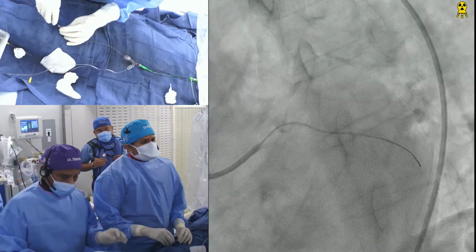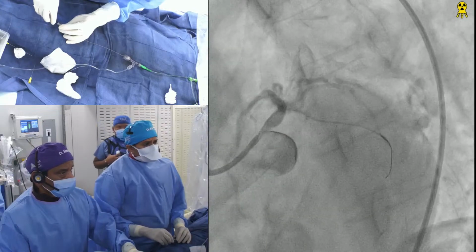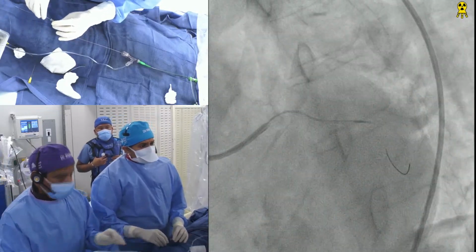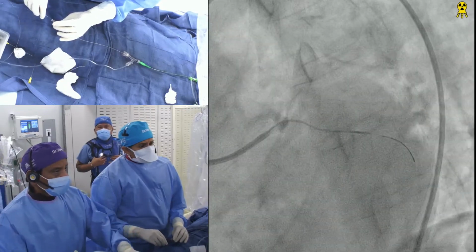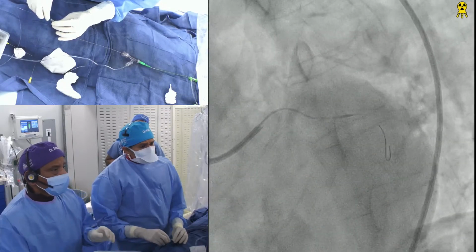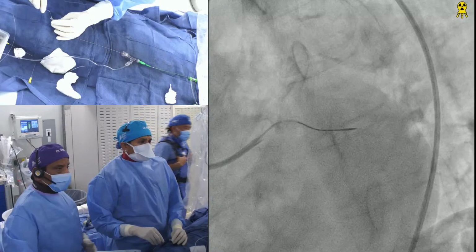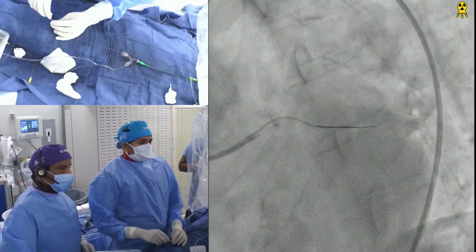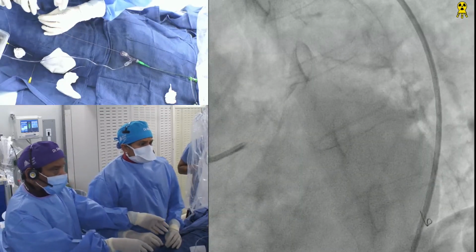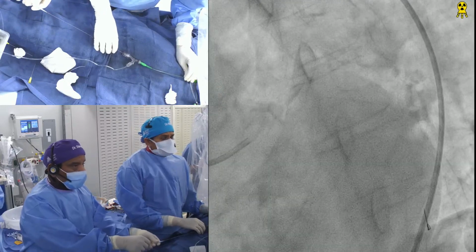Can you give me some dye? Why is this not going way further down? Want to see dye now? Slipped back. You had it in a better position before. No. I think once here we go. There may be in a smaller branch there. Right. Okay, good. Now we are good. Yeah. Now we are in excellent position. You hold it. Yeah, hold it, because you need to. Are we ready, guys? All right, our good team, is the wire ready?